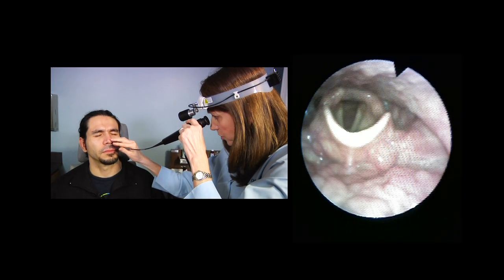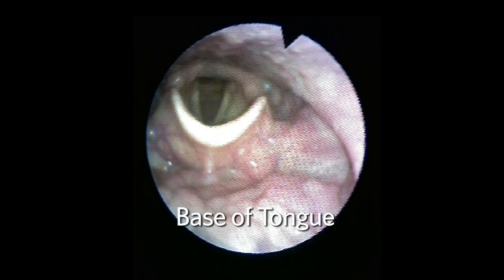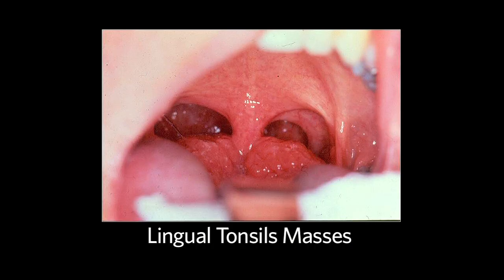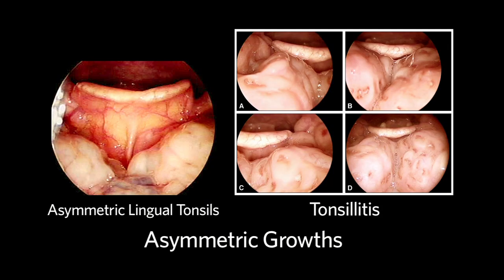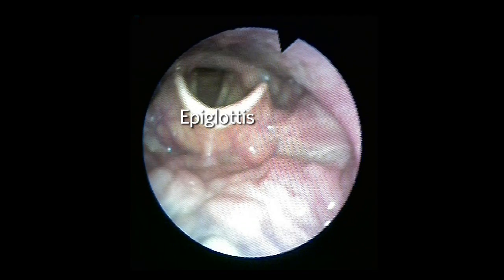We're through the nose. I'm looking at your larynx. The base of tongue with the lingual tonsils are noted, just anterior to the larynx. It's important to look for masses or asymmetric growths, which can originate in the lingual tonsils. The epiglottis is seen posterior to the tongue base. The space between the anterior aspect of the epiglottis and the base of tongue is known as the vallecula.